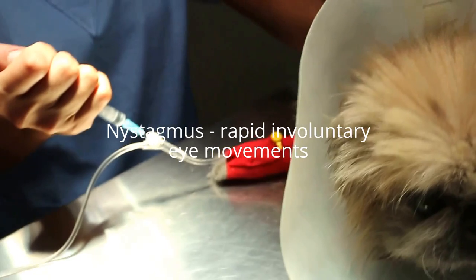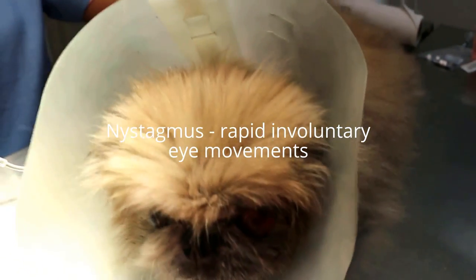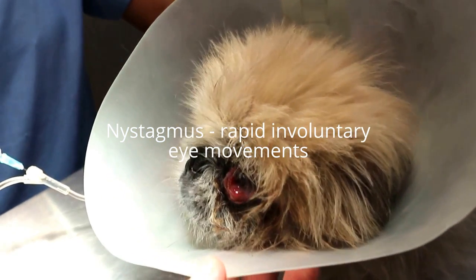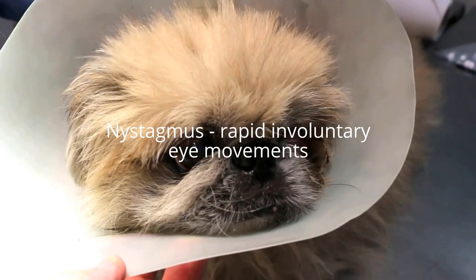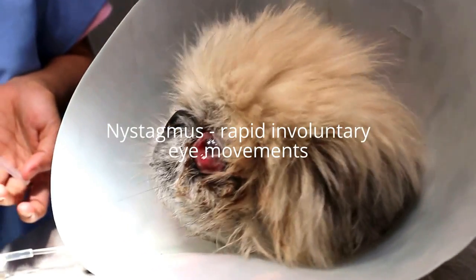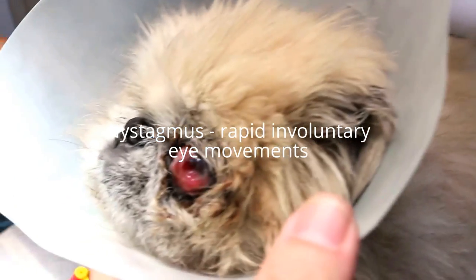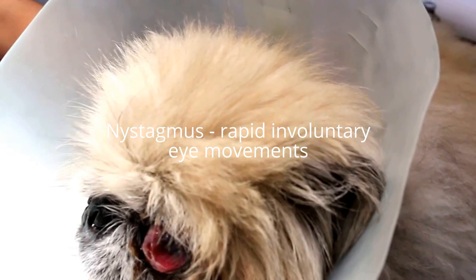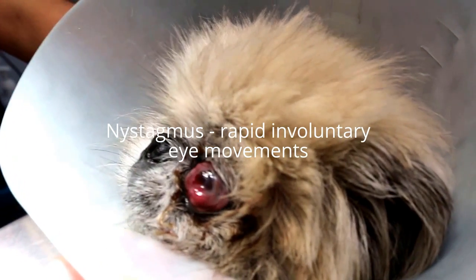30th January 2001, it's a Monday. This is a 13-year-old Pekingese. He had a serious eye injury about two months ago, although he had an ulcer some three years ago. So it's unlikely that the eyeball can be saved. The enucleation will be the solution because the eyeball has come out in a prolapse.